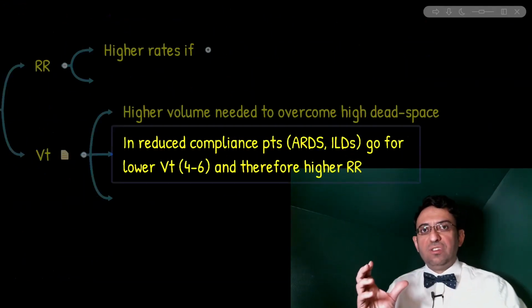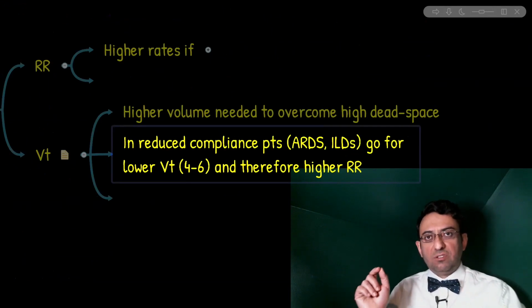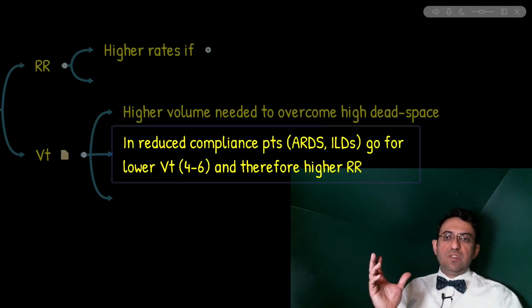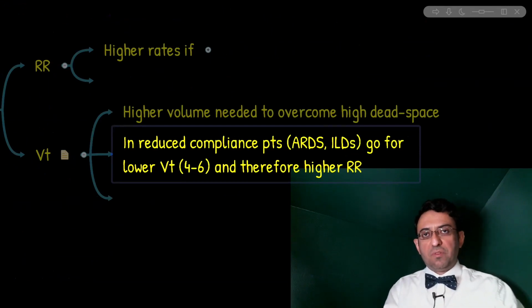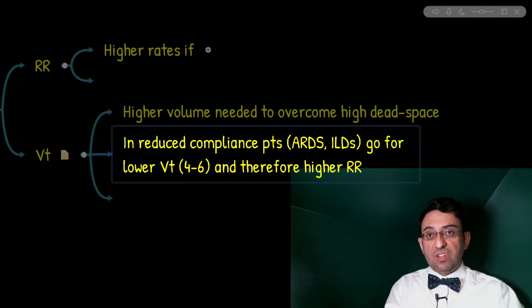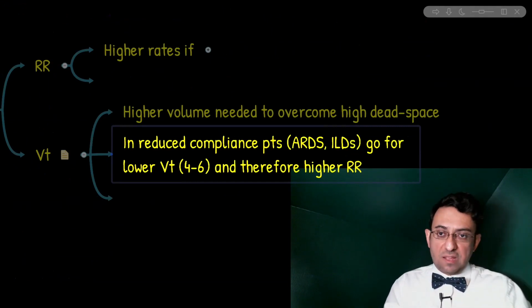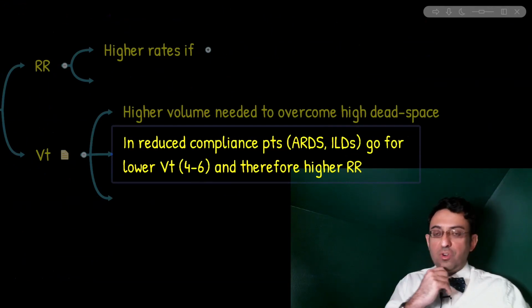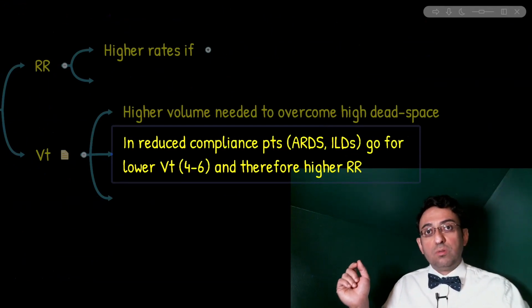How do we adjust these ventilation indices? We adjust them so that the work of breathing is minimized. Now remember, the work of breathing is determined by several factors, including alveolar recoil pressure as well as airway resistance. Also, if you remember from respiratory physiology, COPD is a condition associated with airway resistance, and airway resistance is a concept that depends on the flow rate. Put simply, in COPD we do not want too much flow, so we would usually root for larger tidal volume and fewer respiratory rates.